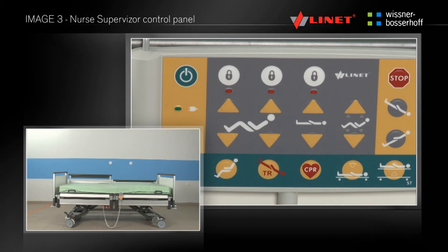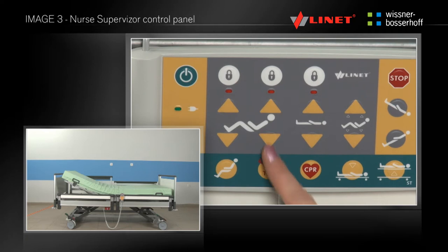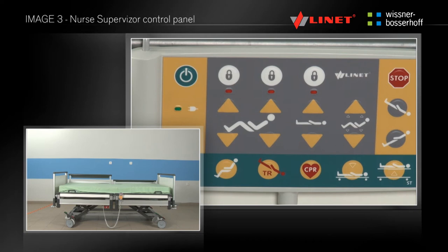In the grey area on the main control panel, there are located the buttons to adjust the thigh rest, the back rest, the height of the mattress platform, and functions of auto contour — a joint positioning of the back rest and thigh part.